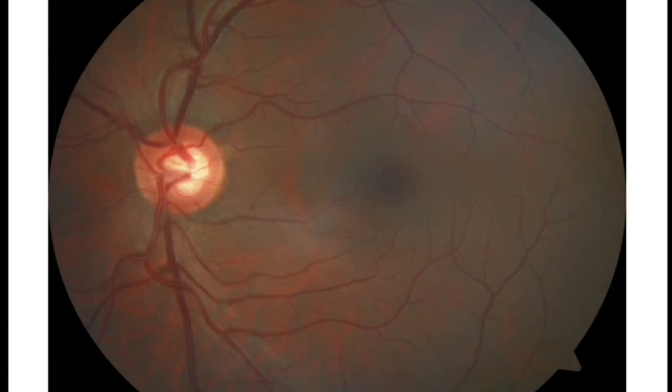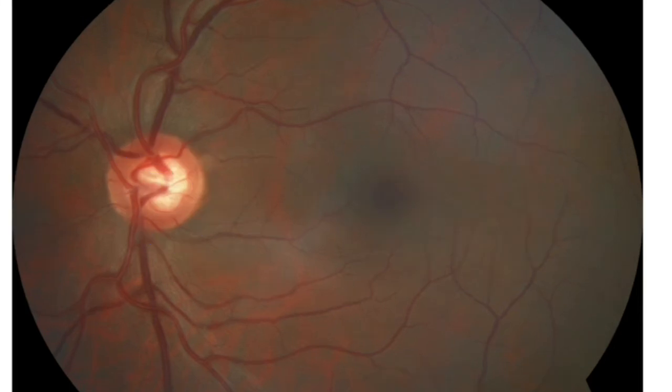And the next thing you examine is the optic cup. The optic cup is examined under the headings of the size of the optic cup, shape of the optic cup, the cup disc ratio, and the depth of the optic cup. As you can see in this picture, this is the optic disc and the white area inside is the optic cup, which is the empty space. There is only lamina cribrosa and the axons are not passing through this part, leading to optic cup formation. And the size of the optic cup usually correlates with the size of the optic disc.